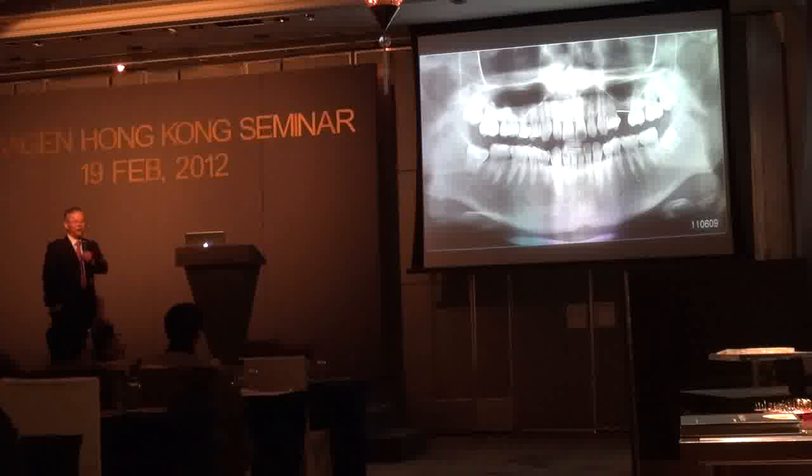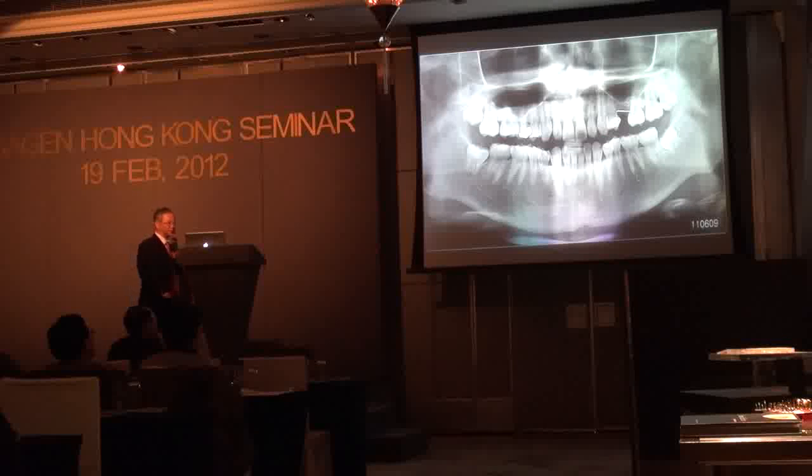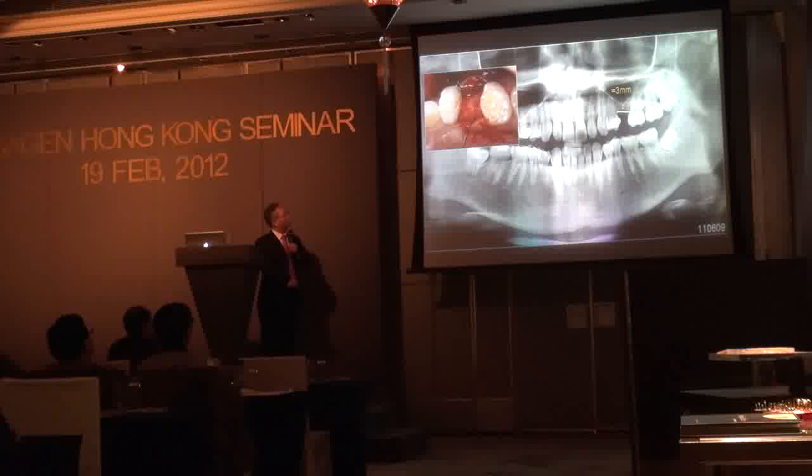This guy is very young, only 23 years old, and he's studying in the United States. He wants to finish. He wants to do something in this area because he has congenital missing teeth. It's like this. This deciduous tooth, primary tooth, was lost, and the height was exactly 3 millimeter, and the width was only 5 millimeter.